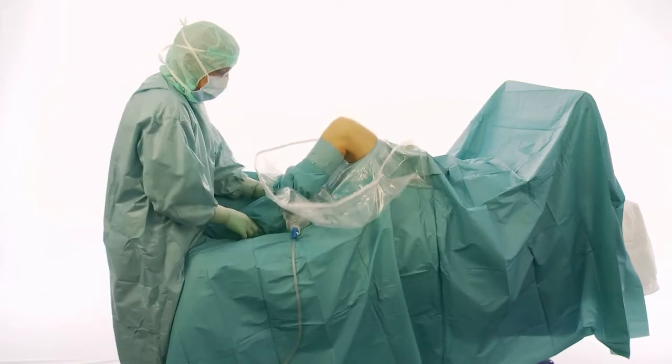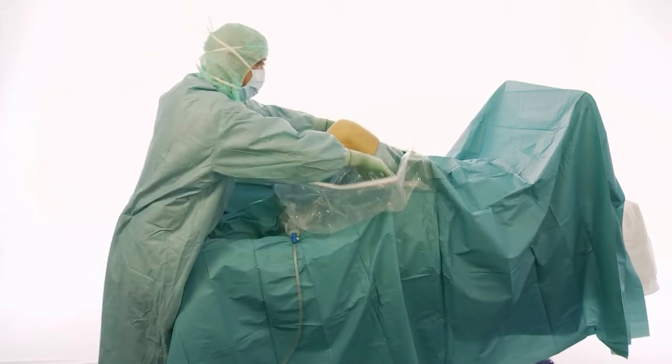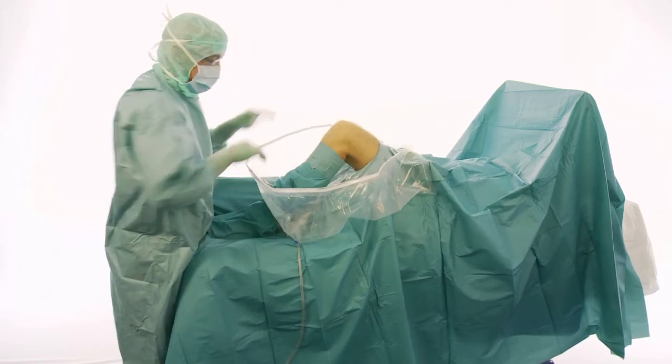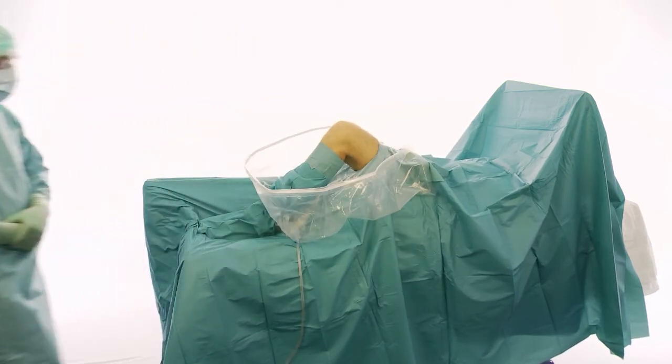Place the leg in correct position for surgery. Draping is then completed.